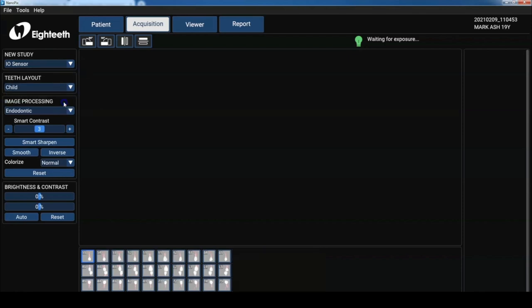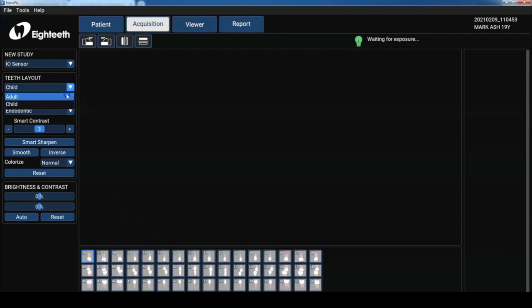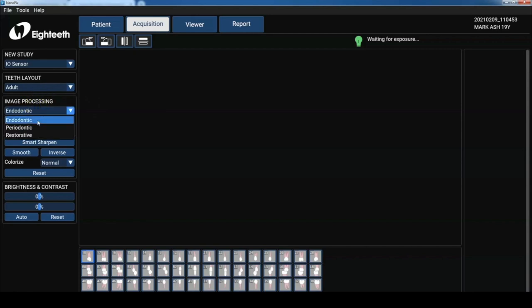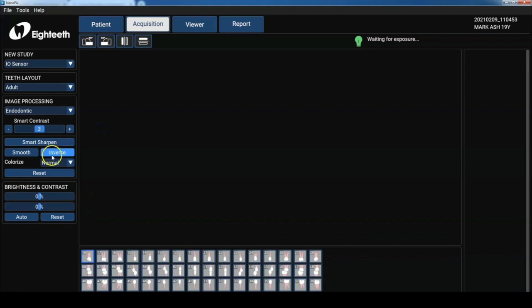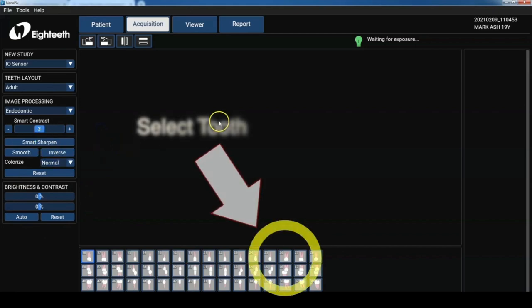We can set up our teeth to be an adult or child. As you can see here, it changes it. And then we can image process using different filters such as endo, perio, restorative. There's a bunch of other buttons. We'll talk about those when we get to the viewer section.